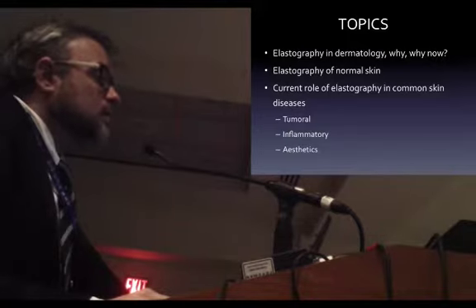Then, why elastography in dermatology? Well, as you've seen with Dr. Bosman, most of the time we have very good diagnosis with B-mode and Doppler. But on some occasions, to detect subtle changes in treatments, subtle changes in the prognosis, and subtle changes in, let's say, the prognostic factors of some of the diseases we are dealing with, I think that B-mode and vascular Doppler are not enough.